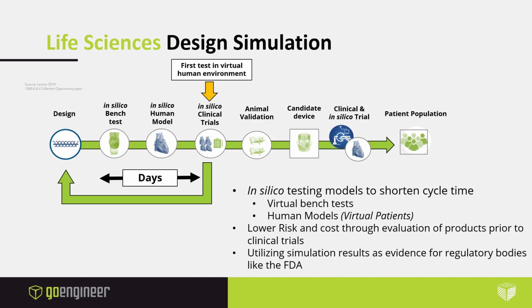This enables them to design device variations and also patient variations in a virtual environment before they actually deliver the first prototype for physical testing. So the first time their device is tested in a virtual human environment is much sooner than in the previous development process that I showcased. This drastically shortens the time taken to develop these devices and also the costs involved before they get into clinical testing. And even during the clinical testing phase, they are typically done in conjunction with in silico testing to correlate existing devices and also to develop variations based on the in silico results.